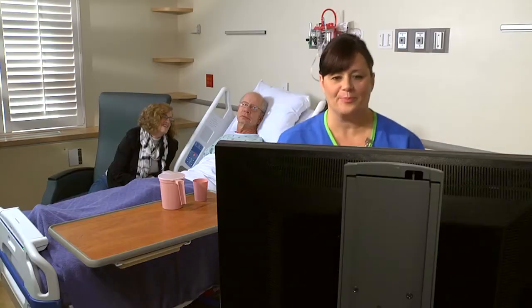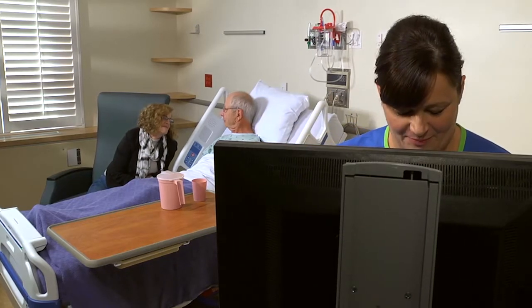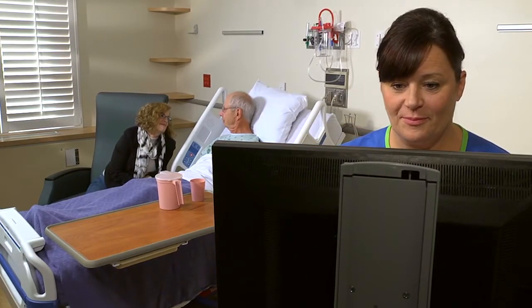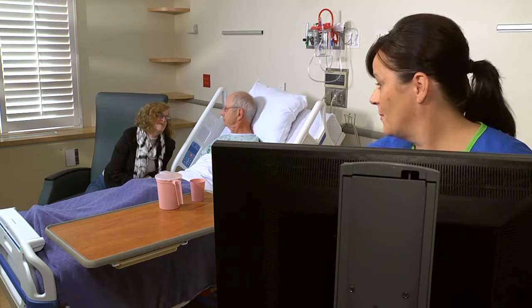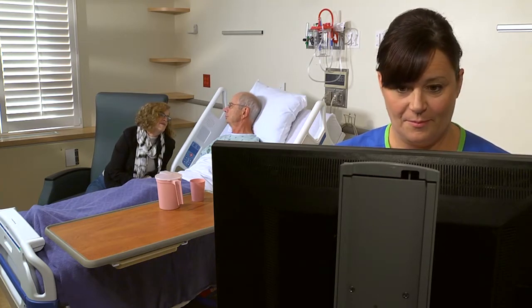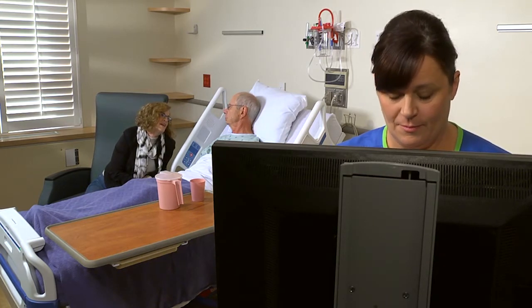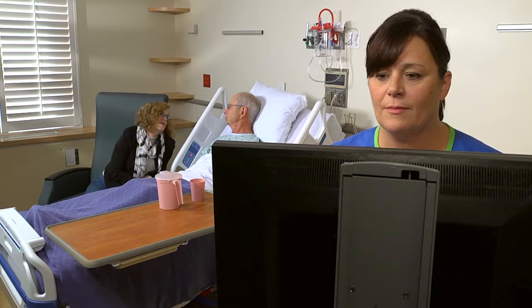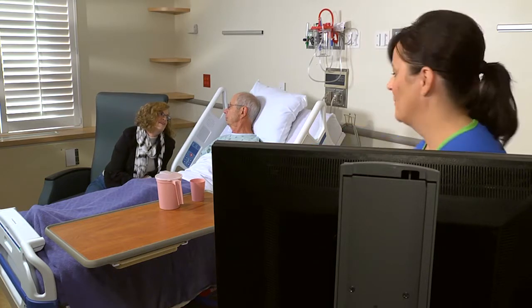Before you apply a restraint, check the health care provider's order. Determine whether a signed consent document is necessary. Next, in accordance with your agency's policy, identify the patient using two identifiers.